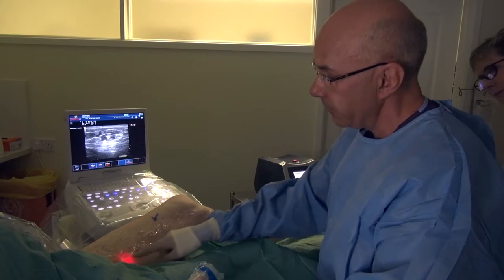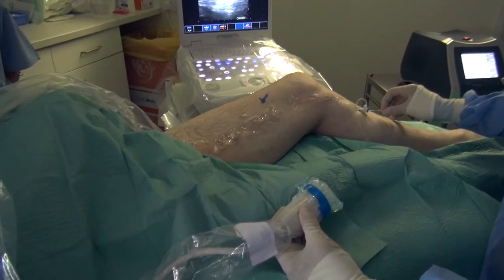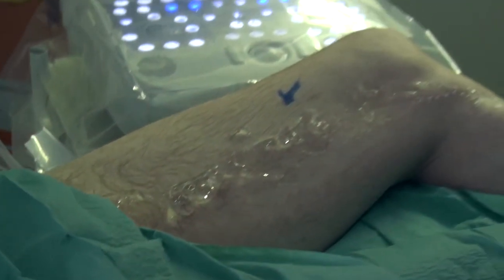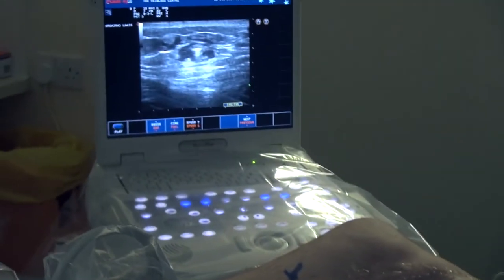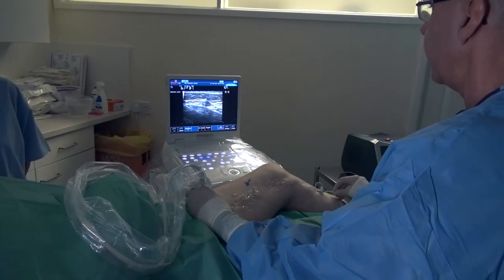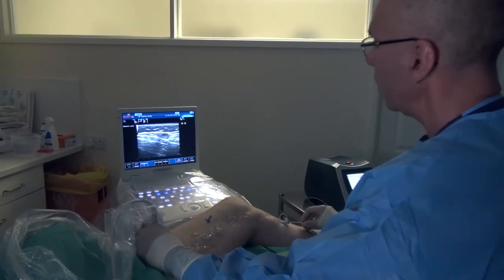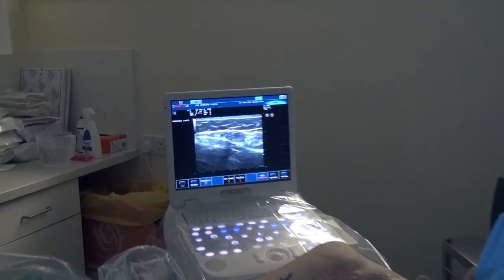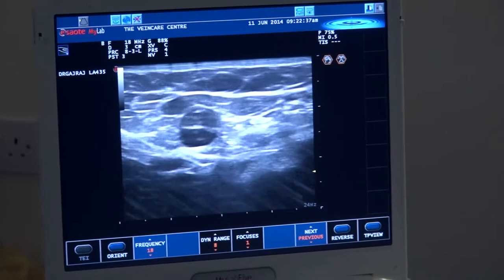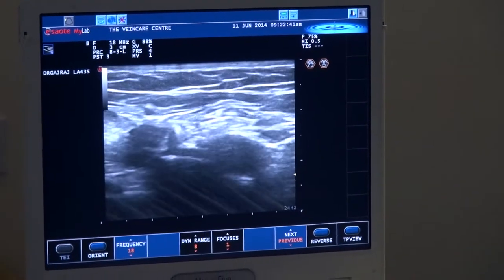We've got the flashing light in the thigh. We're advancing the catheter right up and that's where I think the catheter is probably very close to the junction. Now as you can see on the screen we've got the superficial vein there. It's compressible when I apply light pressure. As I advance it up the leg we can now see it joining the deep vein just there.